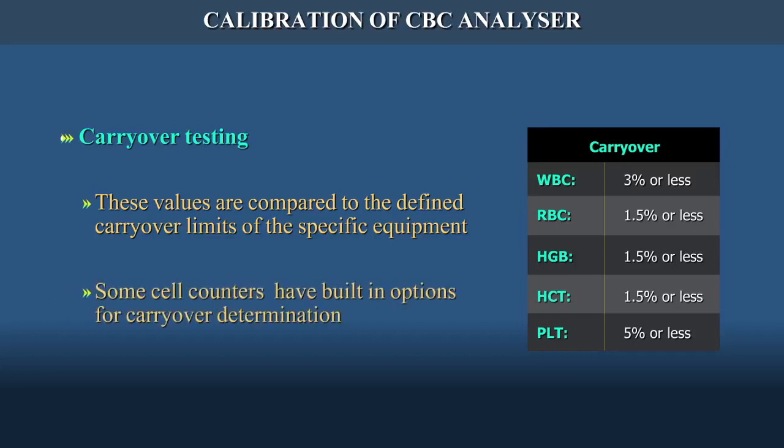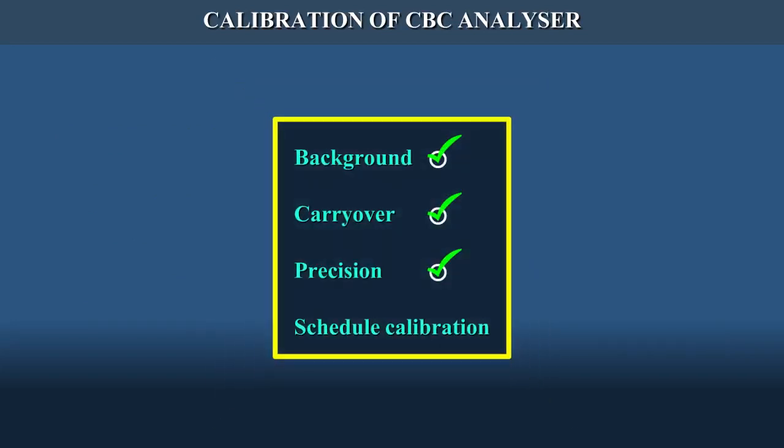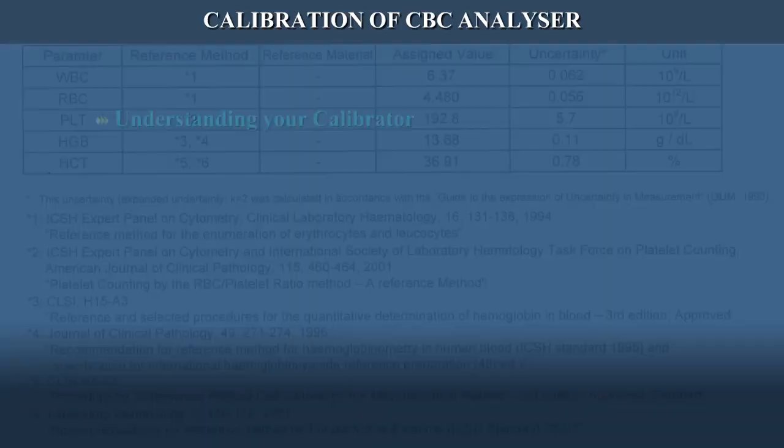Some cell counters have built-in options for carryover determination. If it is not available as a built-in option, use the above method. If background, carryover and precision are okay, schedule the calibration.